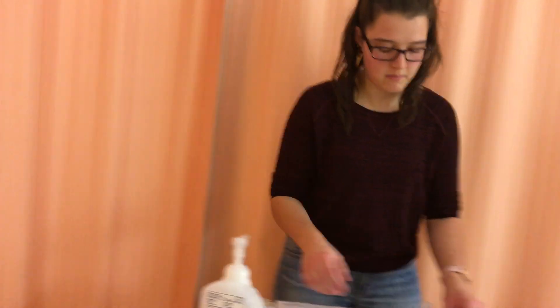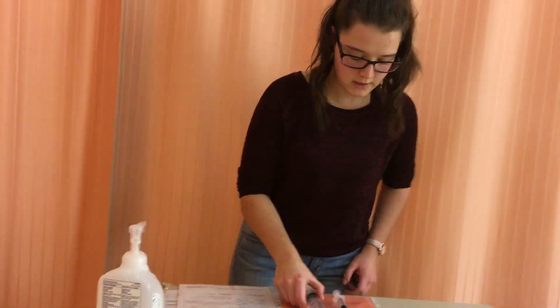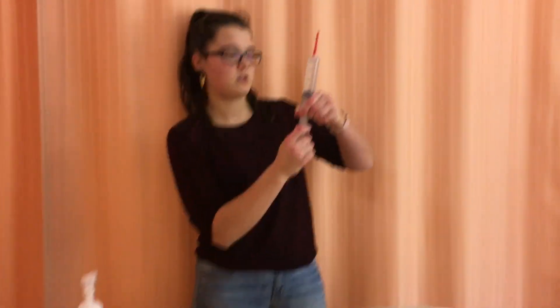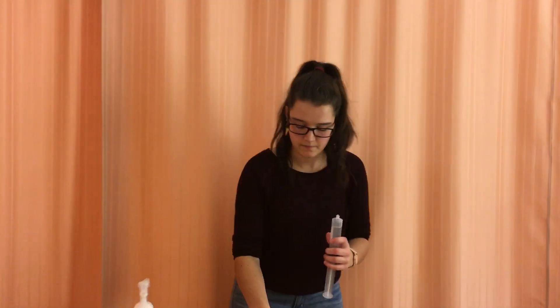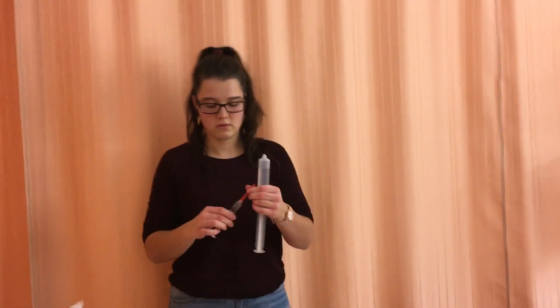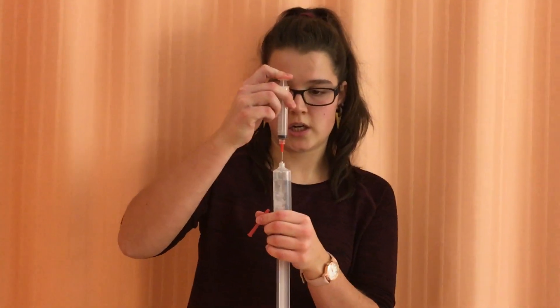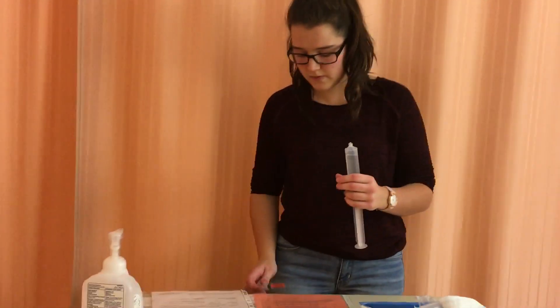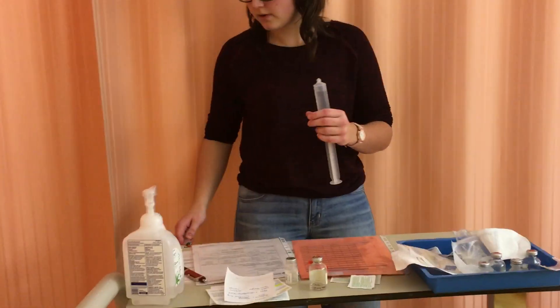I have my 46 milliliters of normal saline. Now I can mix my medications — I've already done my second check. I'll be adding my medication to a 50-milliliter syringe. I'll pull back to make room, insert the medication, and should end up with a total volume of 50 milliliters. I can dispose of the empty vial in the sharps container.